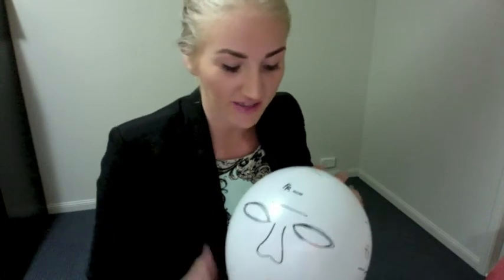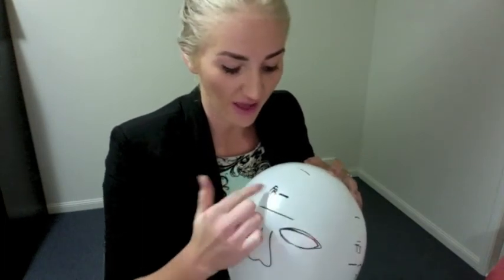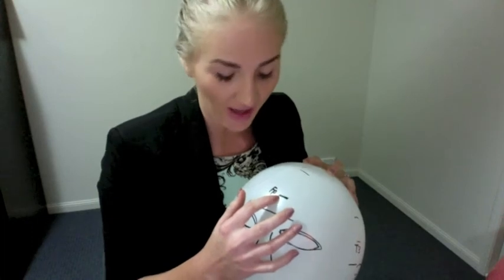So we go from FP around to O, 10% above the inion. And once we have that measurement, we take 10% and we go 10% either side of FP, and that will give us FP1 and FP2. FP1 will go on the left side and FP2 will go on the right side.